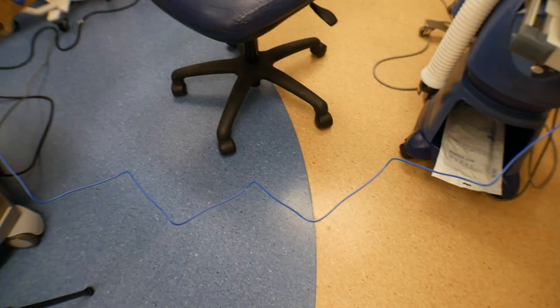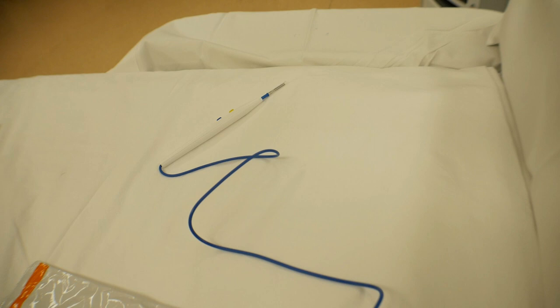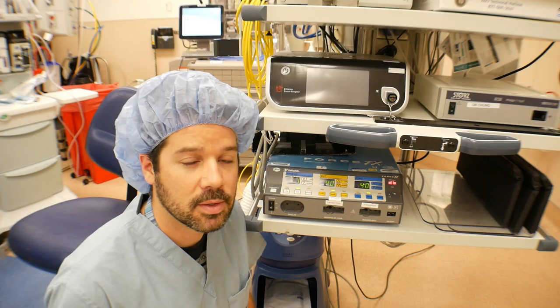The current flows from a generator to a device or an active electrode that delivers the electric current to the surgical site through the patient or the tissue, and it's channeled back to the generator via a dispersive inactive electrode, or what we like to call just the grounding pad or the BOVI pad.